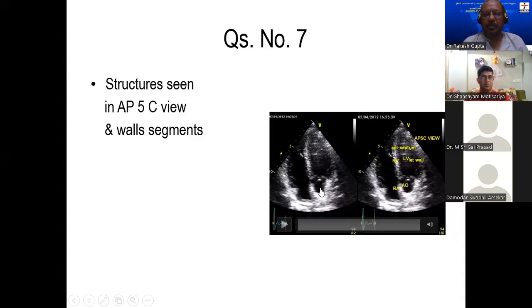Rahul, what do you see over here? So the mitral valve. This is the aortic valve. Anyway, if this is aortic, what is the segment known as?